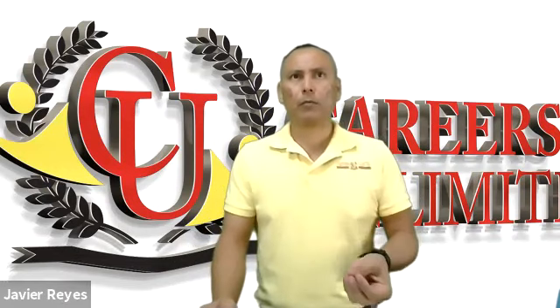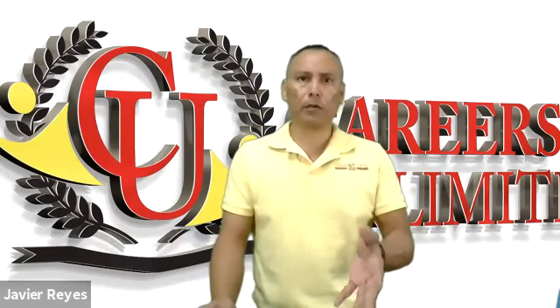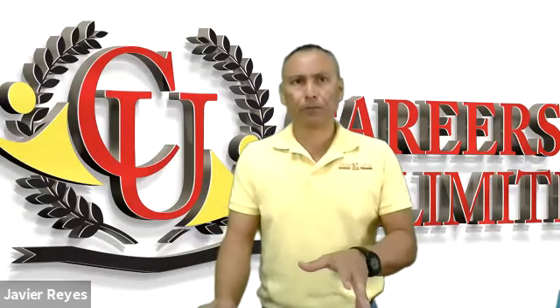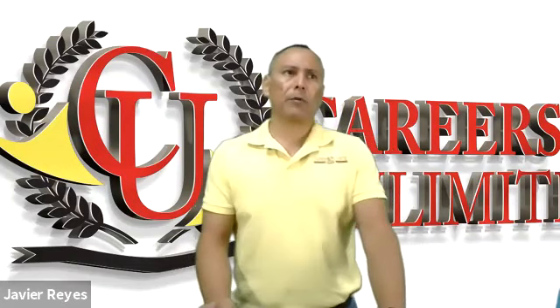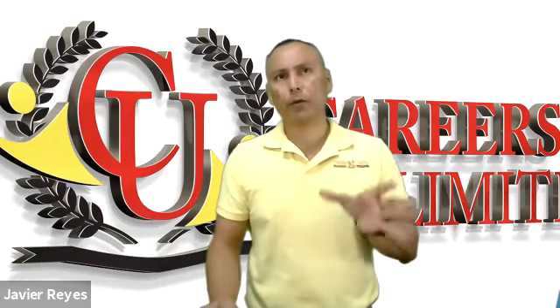So some of the problem sites that you might see are burns. Obviously, when somebody has a burn, it's pretty common sense that you're not going to be puncturing around there. But not only directly on the burn, because when somebody suffers a burn on any part of their body, especially their arms, they're going to be experiencing an increased amount of circulation to the area. As the body tries to repair itself, there's going to be increased blood flow, increased fluids.